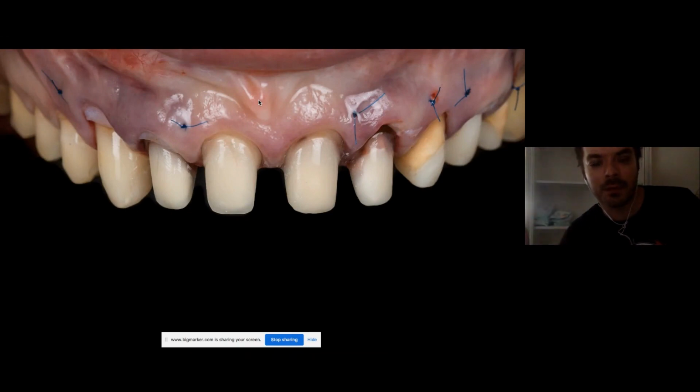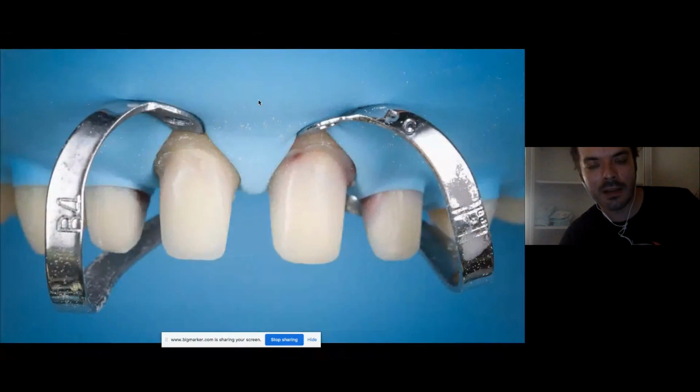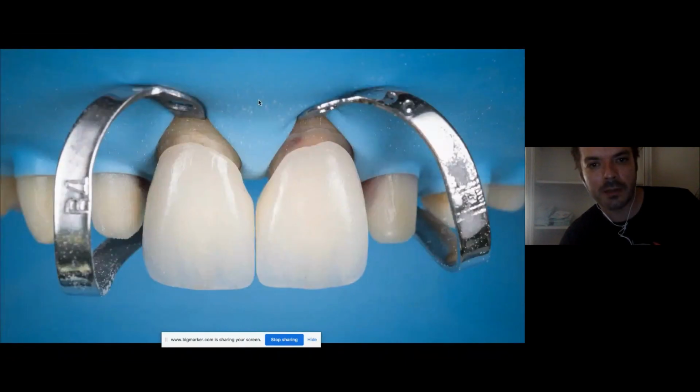At the time of the bonding, we make the graft. So the way we're working is we prep and crown lengthen at the same time, and we bond and graft at the same time. Both of these things have one thing in common as a principle. They rely on something which we all use, prosthetic healing. What is the best healing on an implant? It is the final crown and the final zirconia abutment.